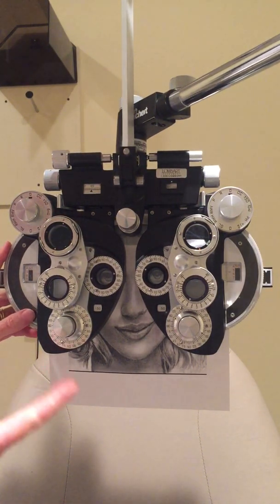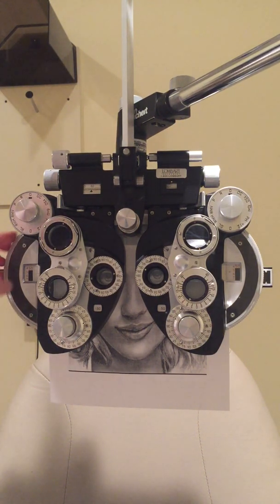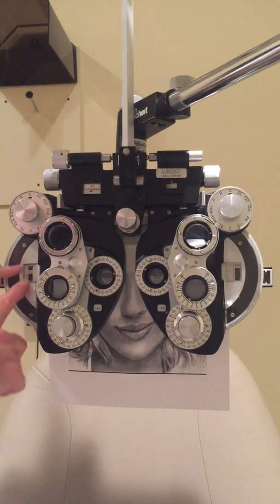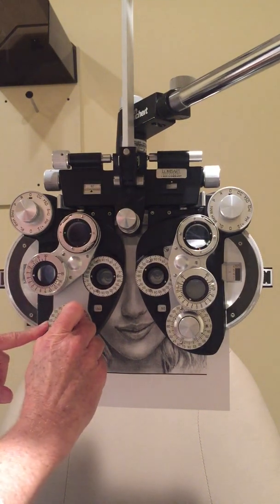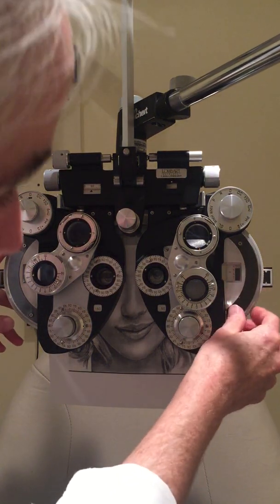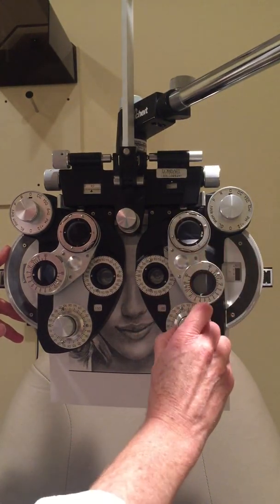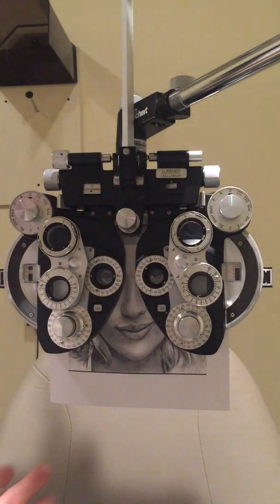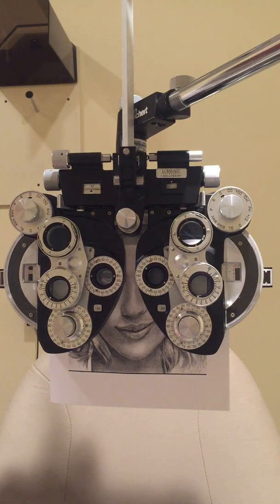I'll enter a starting point into the phoropter — either retinoscopy, autorefract, or the patient's previous glasses. In this case, her previous glasses were -5.00 +1.50 axis 180 for the right eye. For the left eye, her previous glasses were -4.50 sphere with no astigmatism correction. I enter those in, then occlude one eye and ask her what is the smallest line she can read.